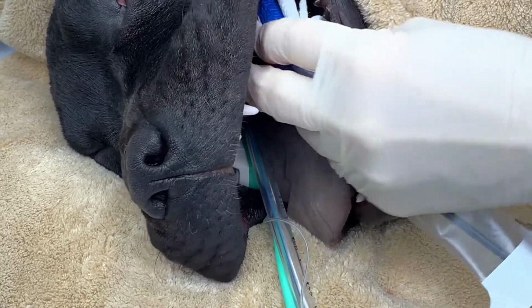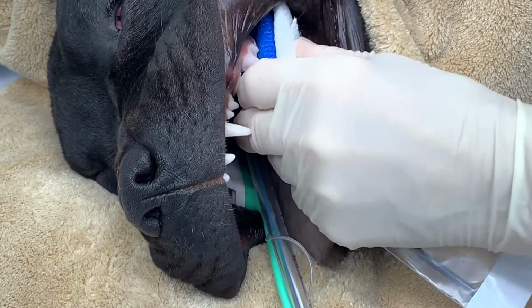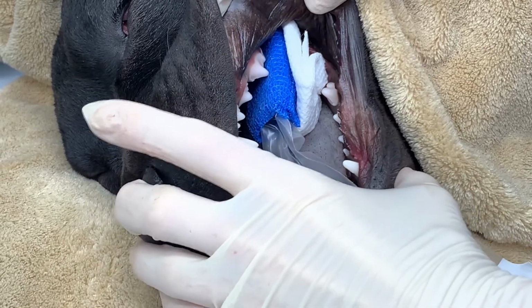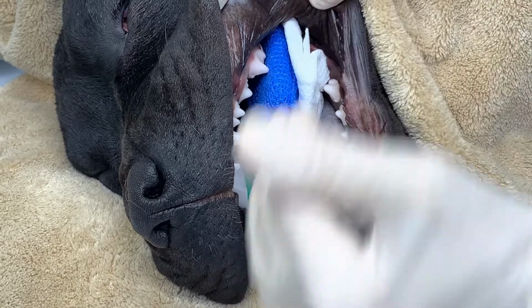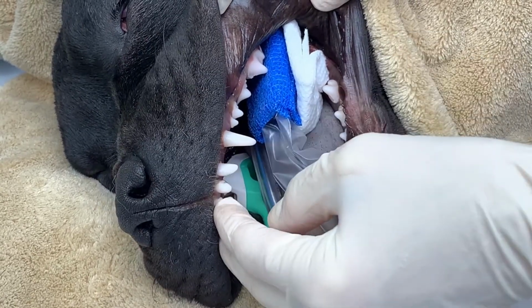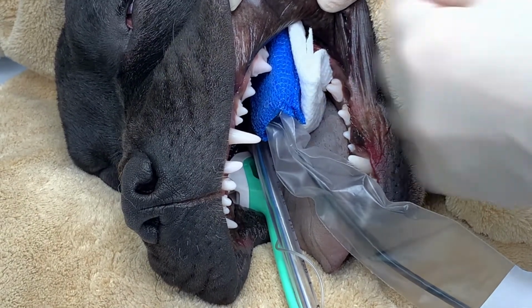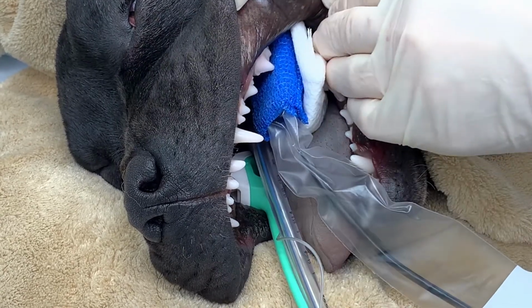We do this without mouth props too. So that's how we would position here. And that guard really prevents the mouth from closing should a patient become light. And now we can just go ahead and acquire these images all the way around to the incisors here, and then we can place our patient in lateral recumbency on the patient's left side. We'll position our sensor guard over on this side, and we can acquire the rest of the images on the other side of the patient's mouth.